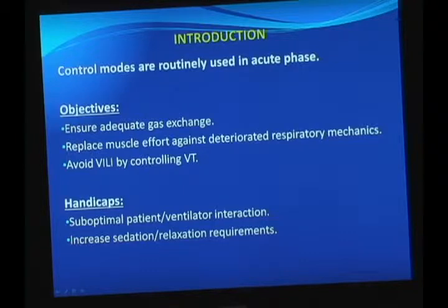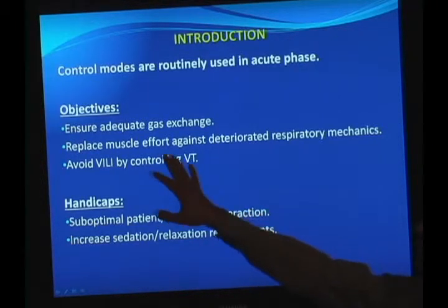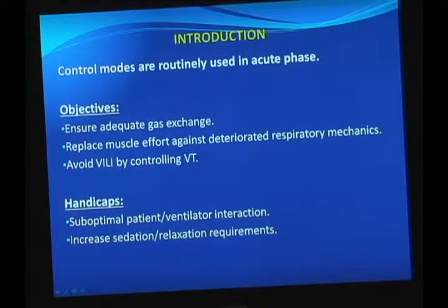As you are fully aware, control modes are the routine method used in the acute phase of respiratory failure, because at that time our objectives are to ensure adequate gas exchange for those very sick patients. We also want to replace the muscular effort that is exhausting against deteriorated respiratory mechanics, and it clearly is a good point for that.